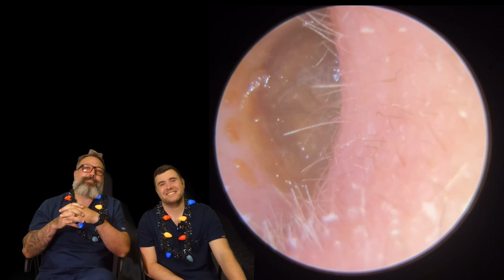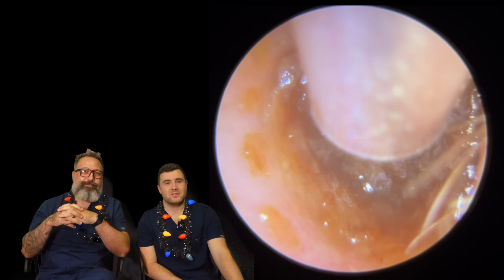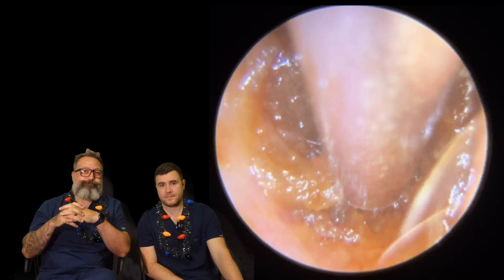That was 2.5 centimetres, an inch as well. I did manage to see that. So this is your patient now. This is mine now. So it looks a little bit different. Bit wet almost. Standard size Zollner tube we've got going in here.